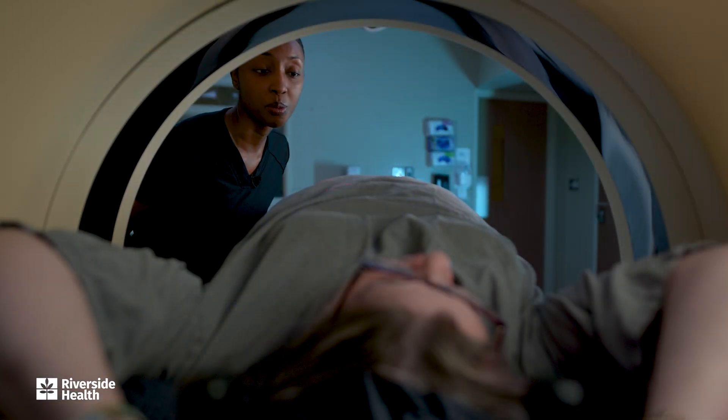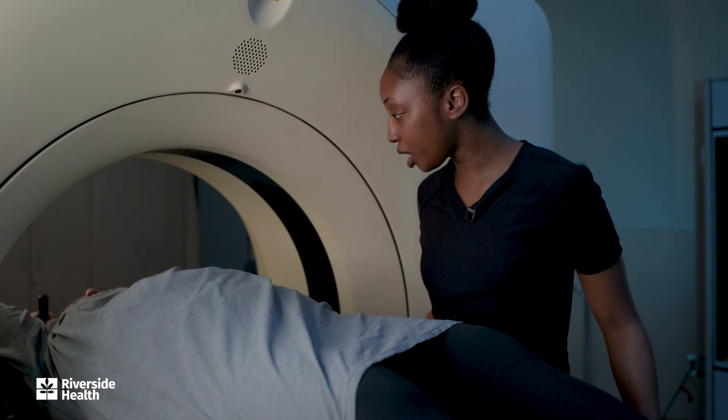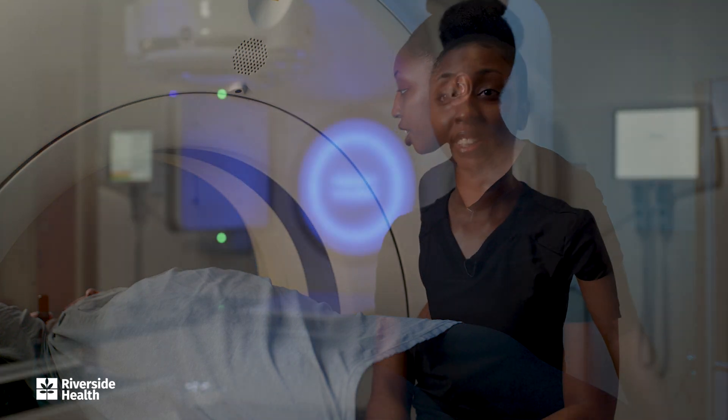I want you to practice breathing until the room turns green. The blue lights mean that you are relaxed breathing — there is no treatment being delivered. Typically you'll see that during your setup or while we are transitioning the radiation beams, and we will coach you through that part as well.